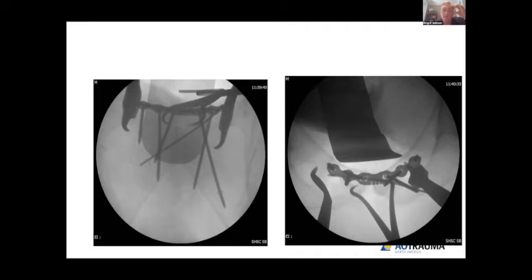The advantage of this plate is it's nice and heavy, has a tendency not to break. One problem though is it's hard to mold to the pubic tubercles, so it pretty much has to sit a little more posterior than maybe optimal if you're going to try to get those long screws down the inferior ramus. So some of the faculty prefer a more malleable plate, but my experience with that is sometimes it breaks in the middle, and I don't like to see the plates break, so I tend to use the bigger one personally. So we fixed the front.